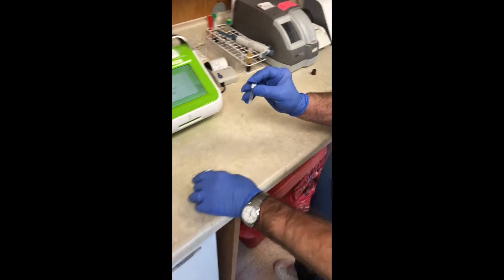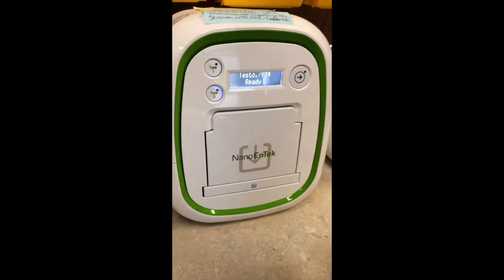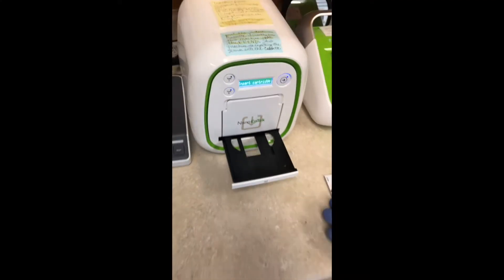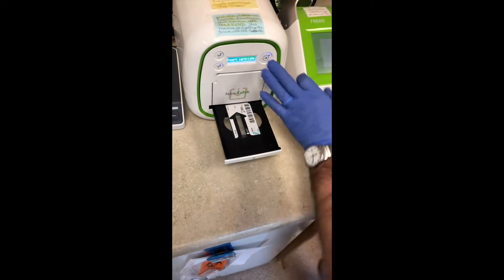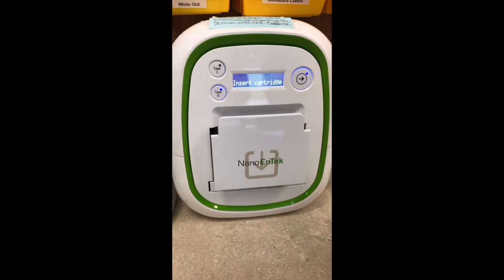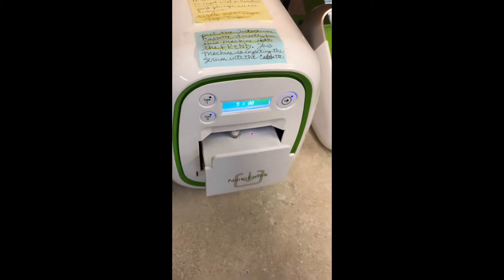Now you're going to put it into the mixing machine. You want to be on type two, which is testosterone. Then you push the button and put the cartridge in, push the button one more time, put the vial in, and then push the button.